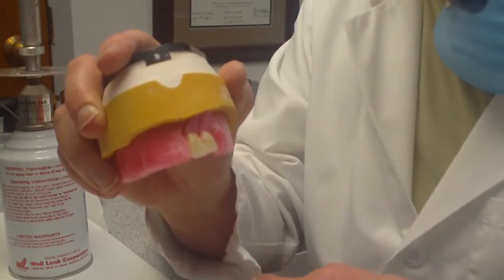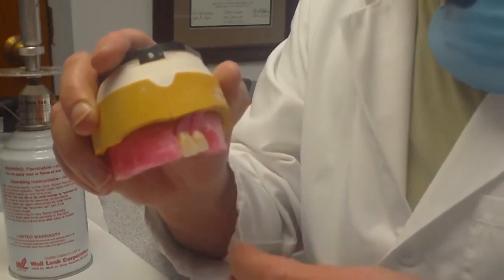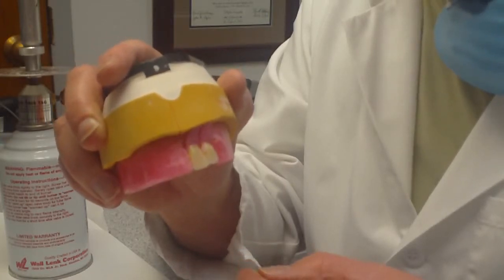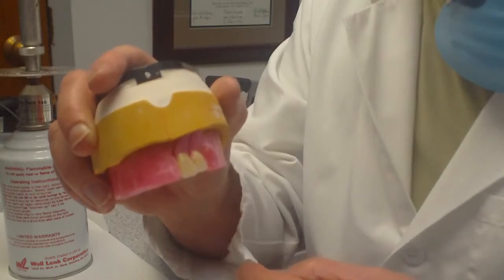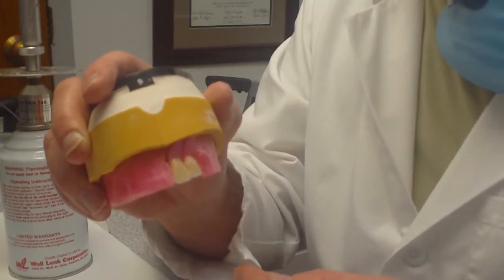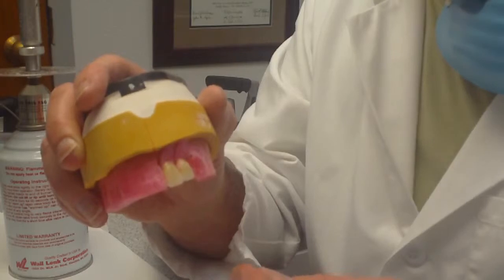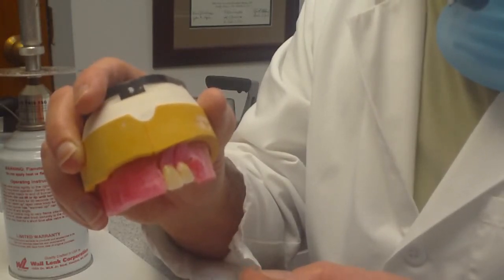It is the corner of the mouth, and it's something to keep in mind, because the more display you have of the distal, the more unaesthetic it appears, the more unnatural it appears, and it gives more of the denture appearance that becomes quite obvious. So positioning the canine is, I can't say it's necessarily tricky, but it's something that you want to pay attention to as you're arranging these maxillary teeth.